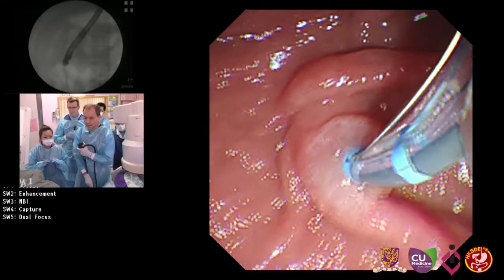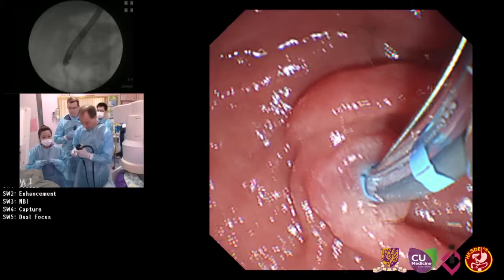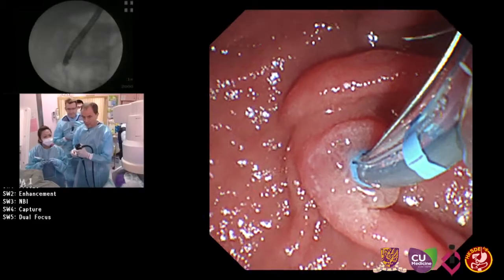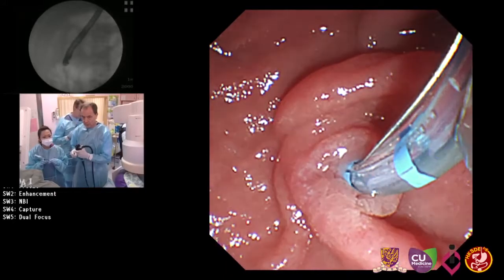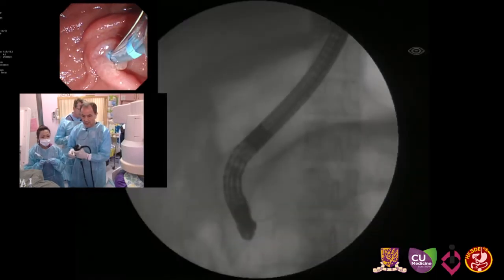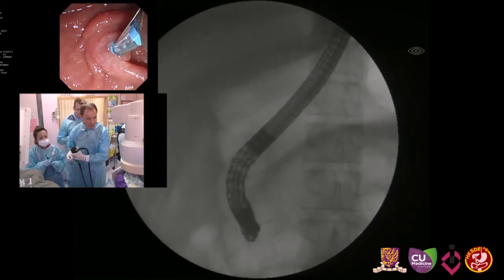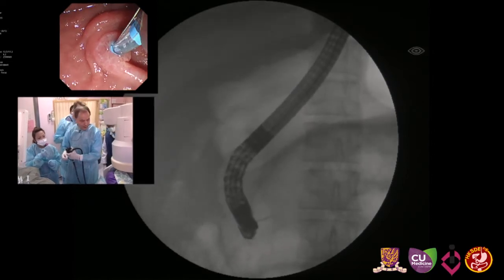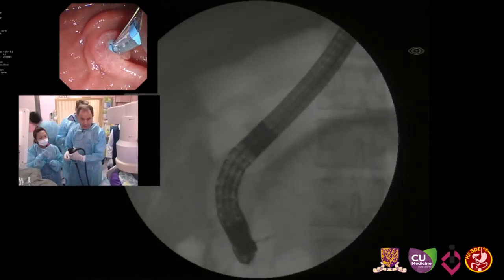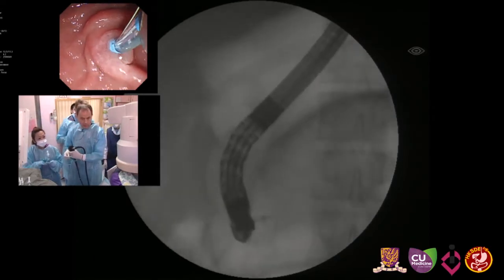So I feel there's some resistance, so at this stage I can now ask Natalie to carefully try to push the wire forward. Can we have the fluoro view, please, a bit bigger? Resistance? Okay. Yeah, a little bit. Okay, so there's some resistance. But at this stage we can inject a little bit of contrast to see the anatomy, and maybe we can magnify the image even more. Okay, inject a little bit. Can we magnify? Okay, yeah. A little bit of resistance here. Okay, so I pull it back a little bit.